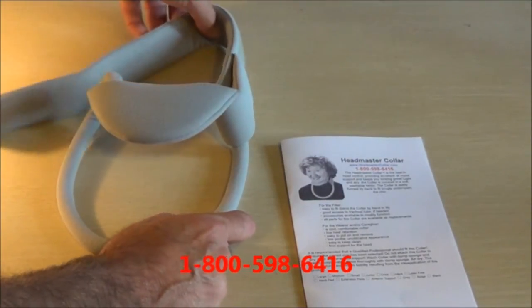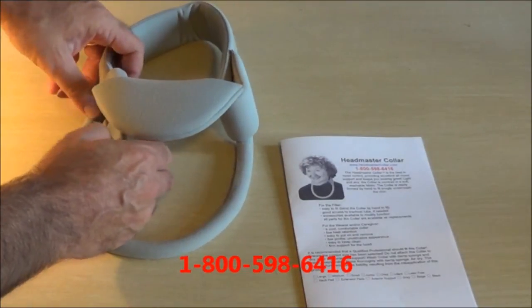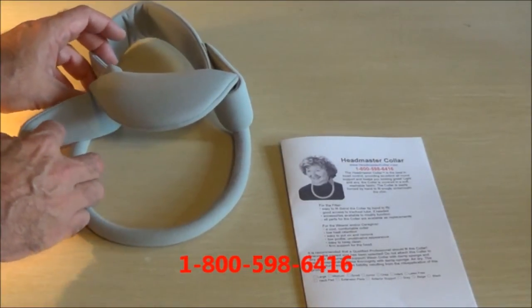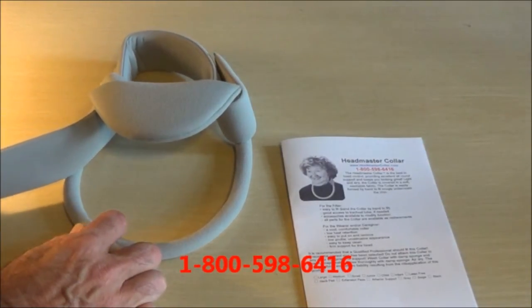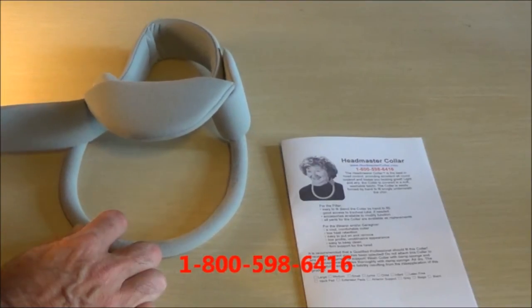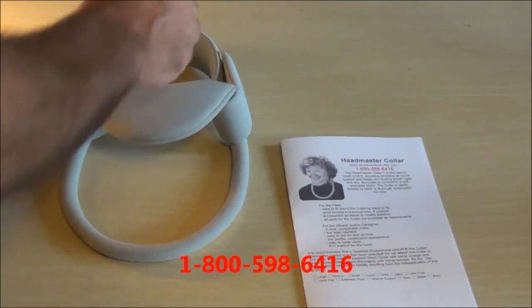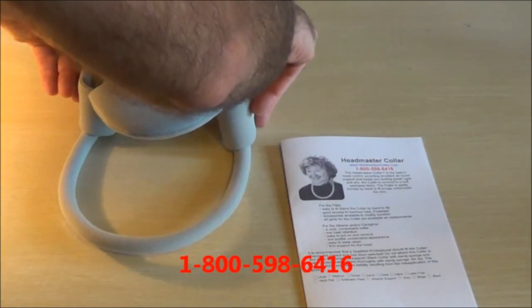The other strap is going to come around — this is where the neck goes — and it's going to attach around here. This gives us the ability to size the collar to make it tighter or looser. Once you have the right adjustment for tightness, it attaches right like that.